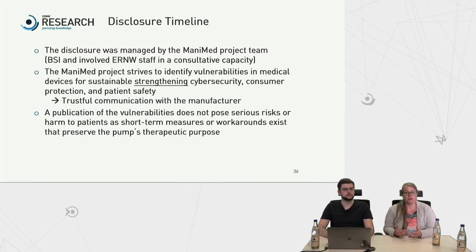As stated before, we aim to live cybersecurity and act accordingly. In our opinion, a coordinated vulnerability disclosure process is desired whenever findings are reported in any device. Julian, me, and our team colleagues managed and coordinated the whole disclosure process. We believe that it is essential to identify vulnerabilities in medical devices in an ethical way to strengthen cybersecurity, consumer protection, and patient safety.